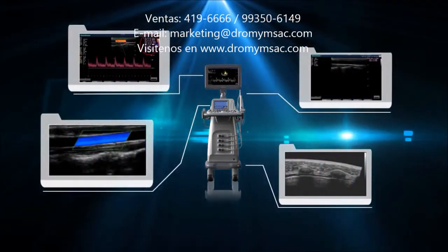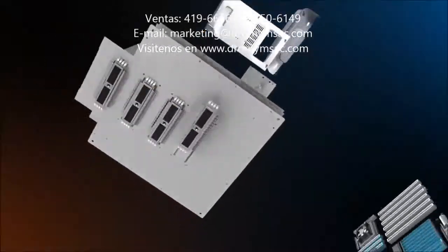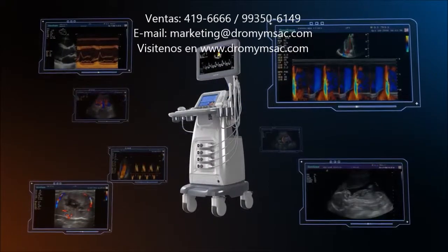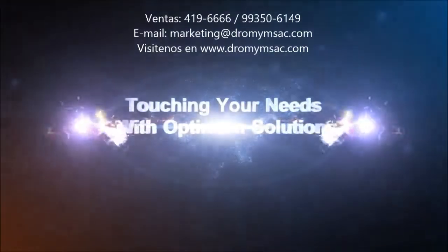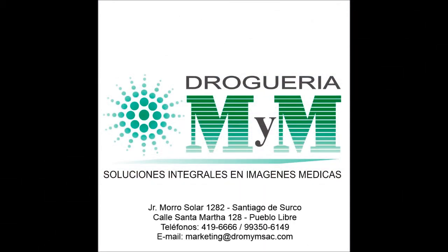Excellent image quality. Powerful software packages. Variable frequency technology. Touching your needs with optimum solutions. Sonoscape S20, 2011 new release.